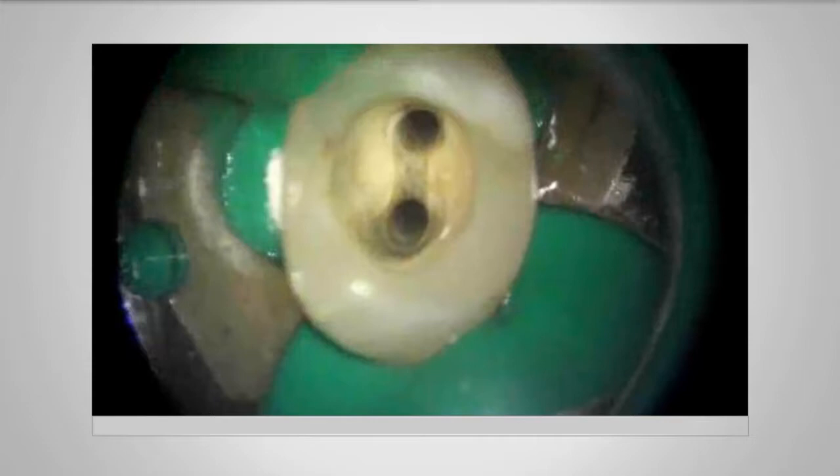The Endoactivator, I've been asked if it heats the bleach. It doesn't actually heat the bleach. All it does is agitate it. So I do use a 3% hypochlorite solution, and I've heated that in a baby bottle warmer so that it is warm.